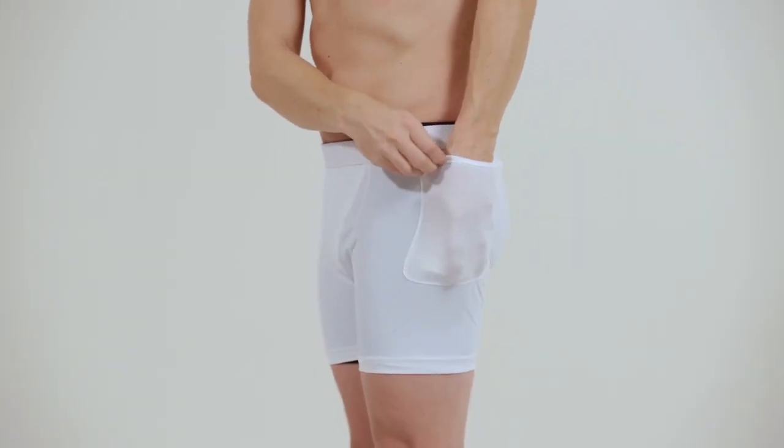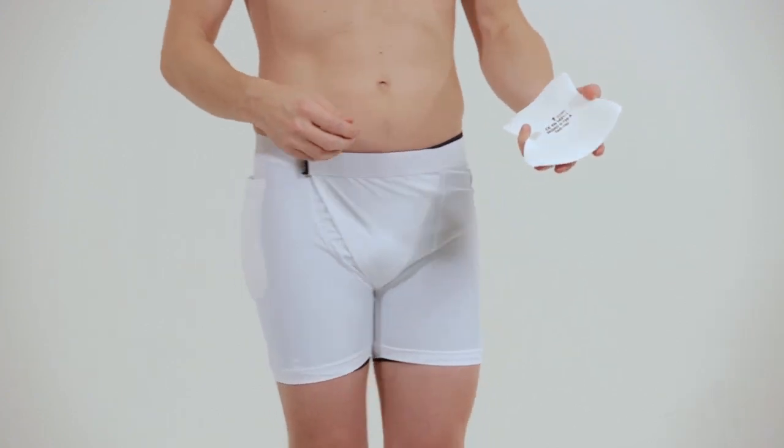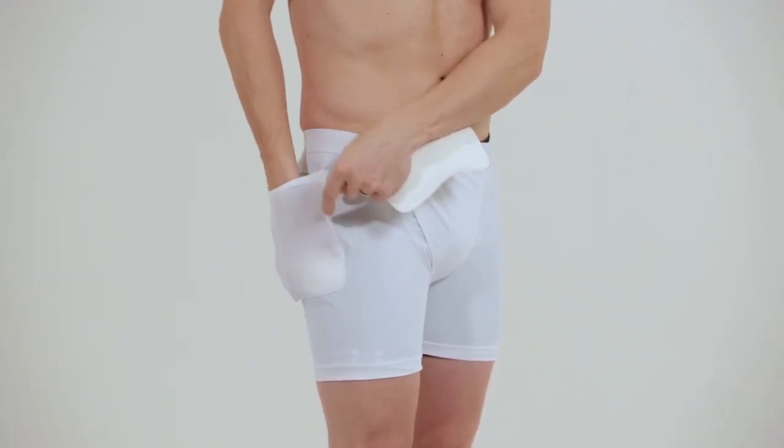When it's time to wash Happy Hip, remove the protection pads by slightly folding them with your hand.